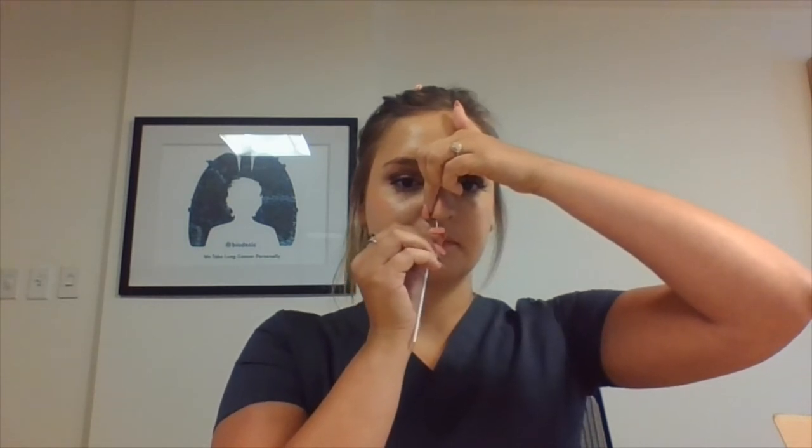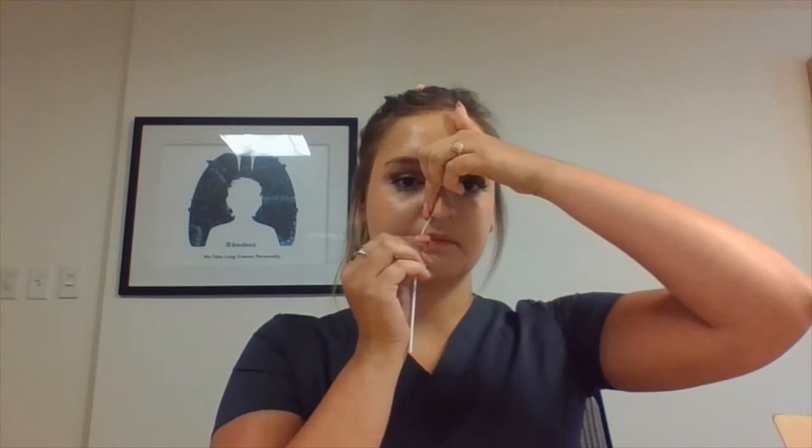Count to four: one, two, three, four. Making sure to rub the inside of the nostril to ensure an adequate sample is collected. Now place the swab in the other nostril and repeat. Place the index finger on the outside of the nostril and count to four: one, two, three, four.